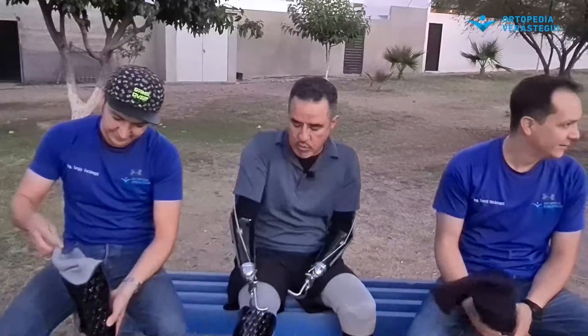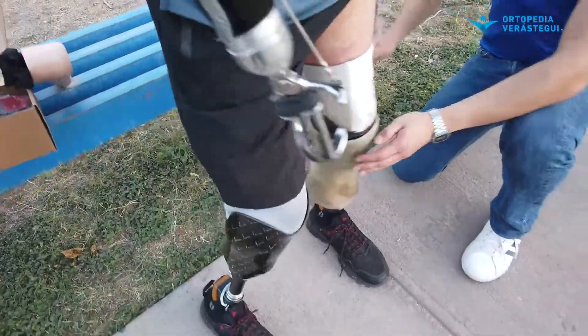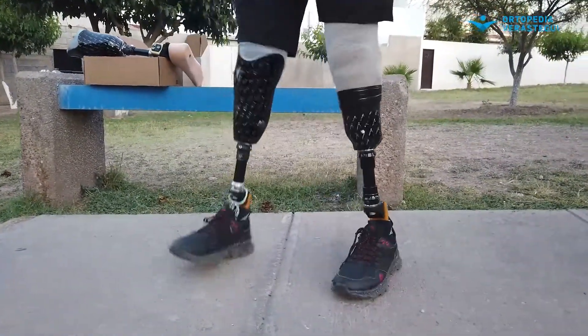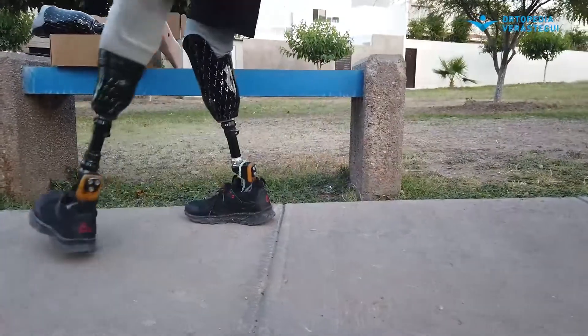Sé que es un poco más alto el costo de este sobre el convencional, pero tan solo con no fatigar ni sacrificar las rodilleras yo creo que se compensa, porque también esta la puedo cambiar cada dos o tres meses dependiendo de la actividad, y esta va a tardar más tiempo. En cuanto a lo estético, el socket queda libre, puedes ponerte el diseño que tú quieras — el de Chapulín Colorado, el de Iron Man, lo que quieras — y se va a ver. En cambio aquí, pues se pierde.